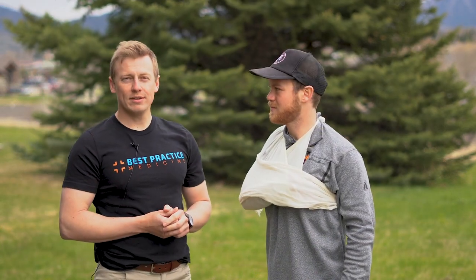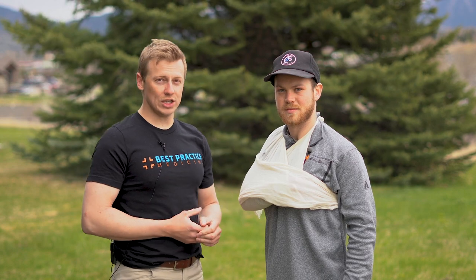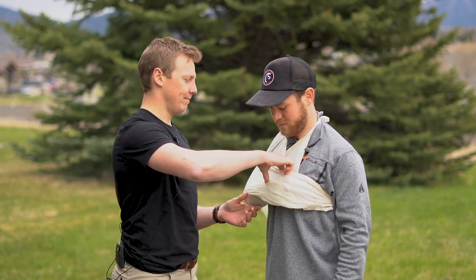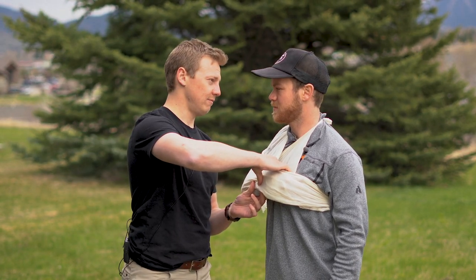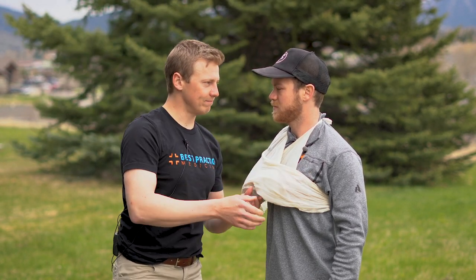After splinting the extremity, recheck the patient's circulation, sensation, and motion in the injured extremity — radial pulse, what finger am I touching? My thumb. Wiggling for me. Great.